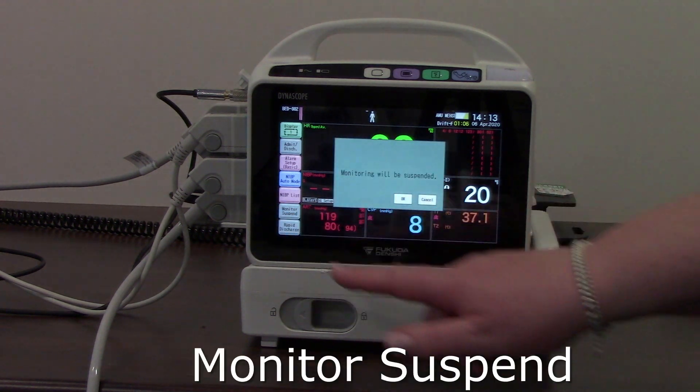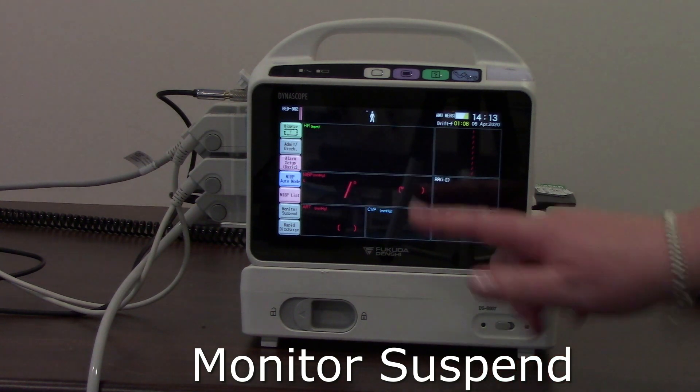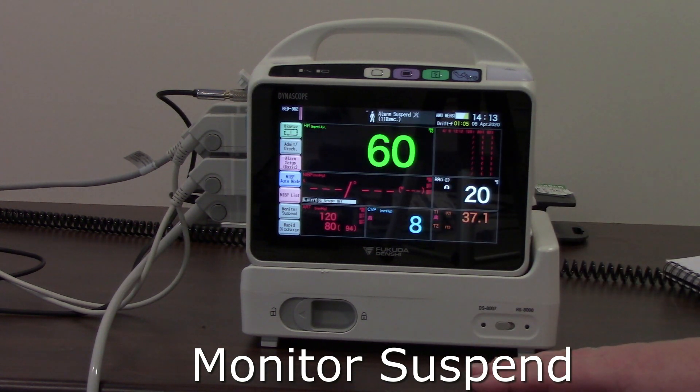Monitor suspend will temporarily suspend your monitoring. It will save all of the data until you're ready to go again, and then bring it all back to the forefront.